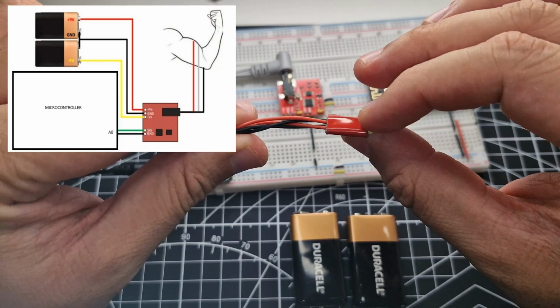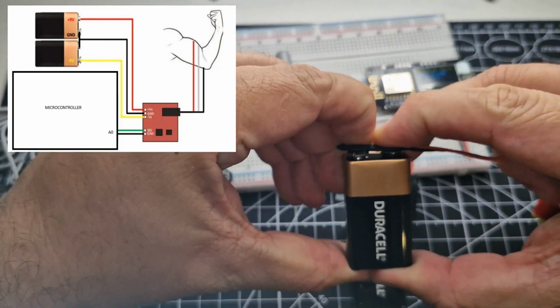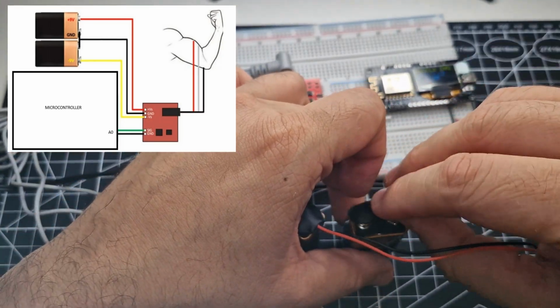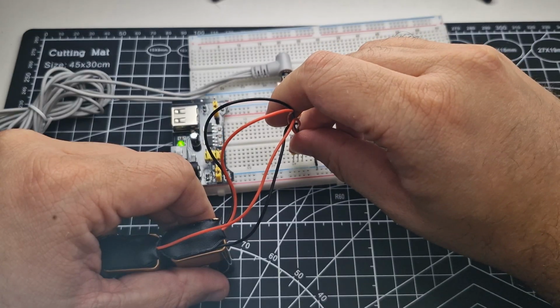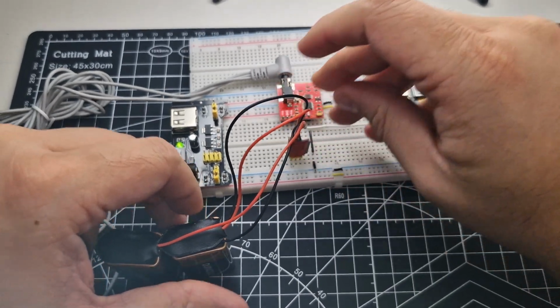We connect 2 9-volt batteries to provide a symmetrical power supply, meaning we connect the negative terminal to the positive terminal of 2 different batteries, resulting in 3 wires. One will be the positive voltage, another the reference, and the third the negative voltage.